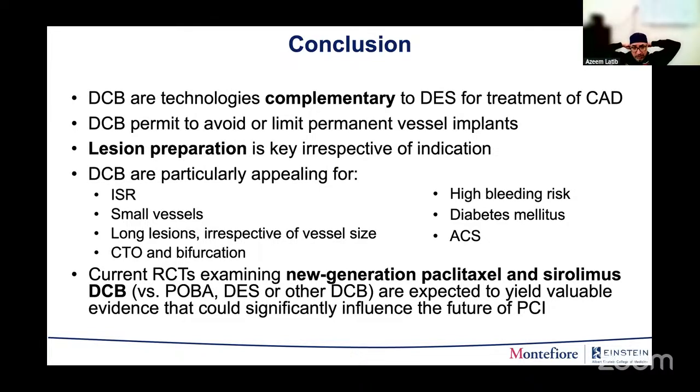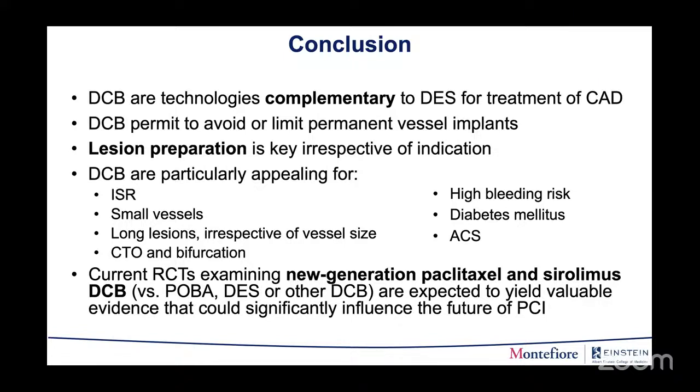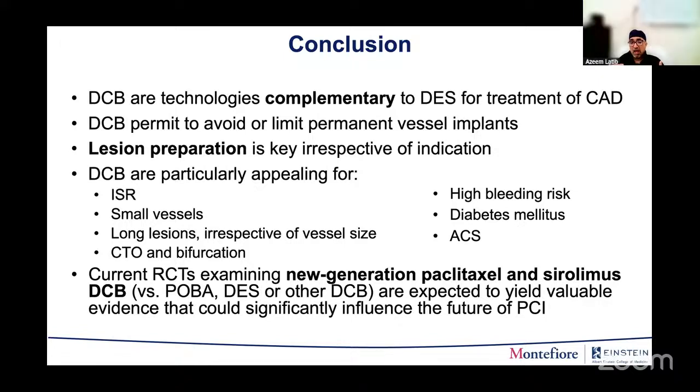Of course you can, and you should do what's safe for the patient. If you're worried about the dissection, you believe it may not close, you should go with another balloon or even put a short stent to seal the dissection, okay? Do understand, though, that when you go with a balloon after the drug-coated balloon, you're diminishing the effect of the drug-coated balloon because by ballooning that area you'll disrupt the excipient, the drug that's there, and you'll probably lose a lot of it.